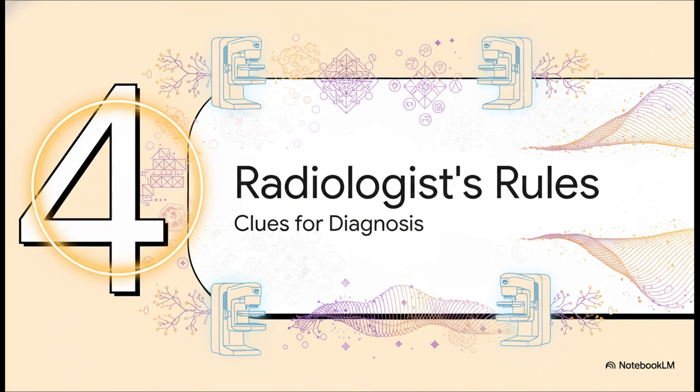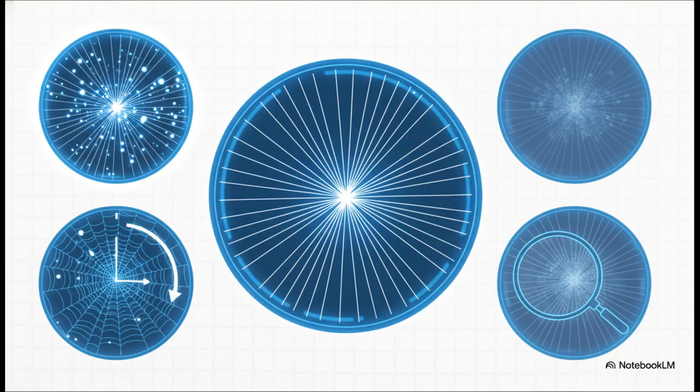So with all that in mind, what are the bedrock fundamental rules that guide a radiologist through this whole complex investigation? Let's break down the key principles they have to live by whenever they come across AD. Okay, so these are the big ones. Those radiating lines to a single point, that's your classic sign of AD. Now, if you see those with tiny little calcium deposits, what we call calcifications, that often points to something called invasive ductal carcinoma, or IDC, along with its precursor DCIS. But if you see the AD without any calcifications, well, that's more suspicious for a different type, invasive lobular carcinoma, or ILC, and that one's known for being extra sneaky.